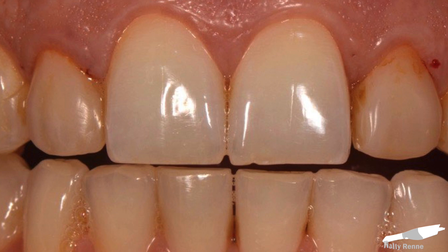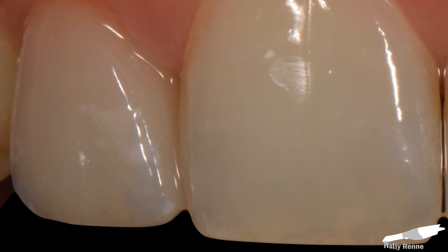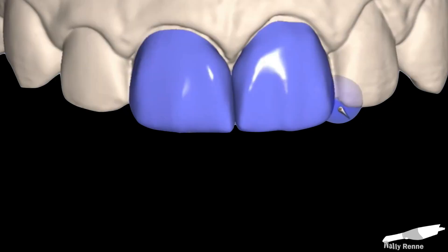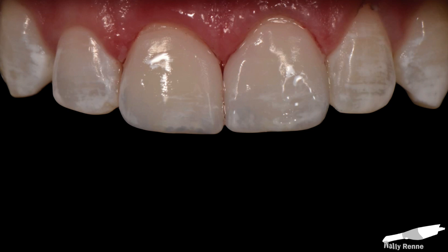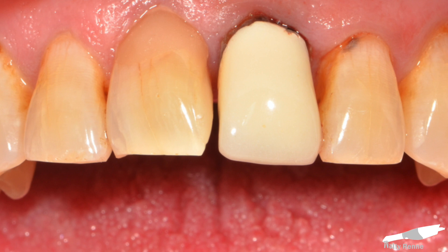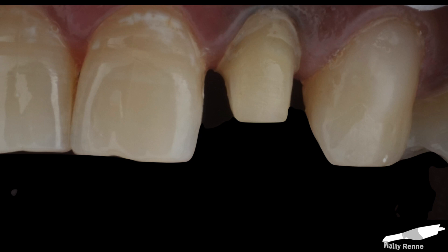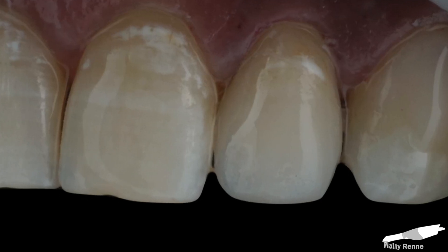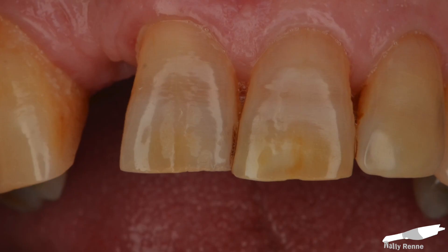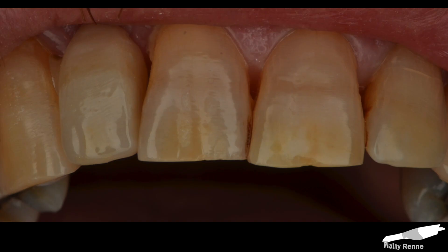Hey guys, Wally Rene here, and today we're going to talk about adding a little custom characterization to your anteriors. What separates a mediocre milled restoration from a fantastic restoration is the time spent after milling. I would say the restoration is about 75% done when it comes out of the mill. And it's the easiest thing in the world to add a little bit of love after it pops out of the mill. I am by no means an artist — I think this is just really fun and simple to do.